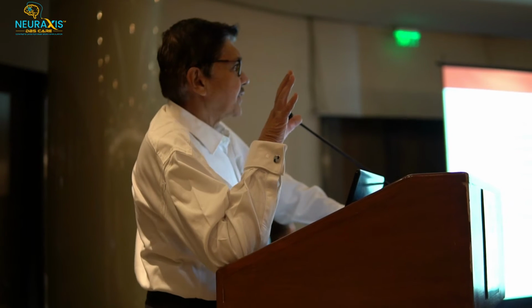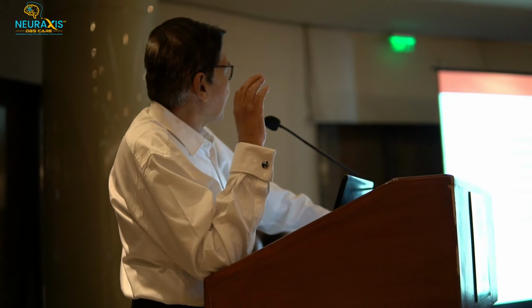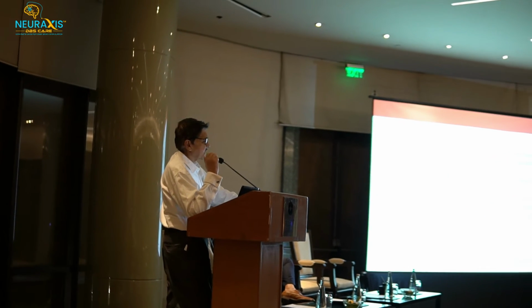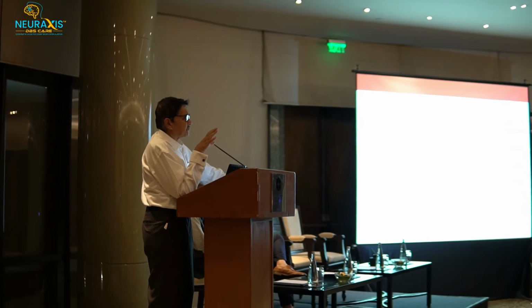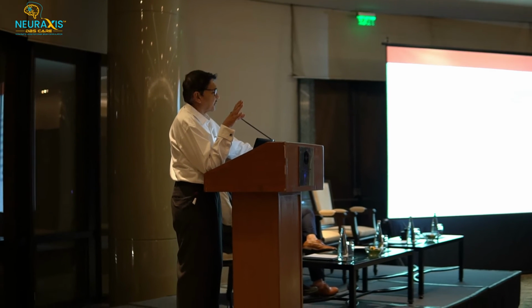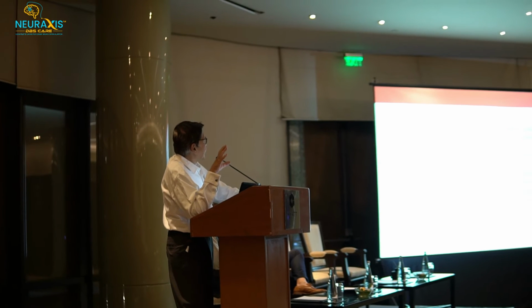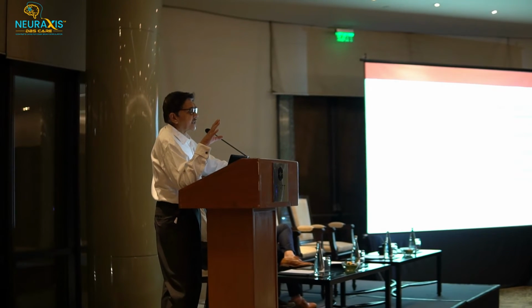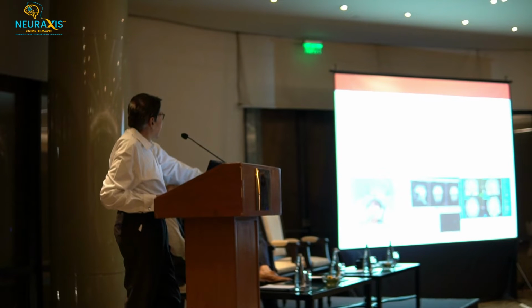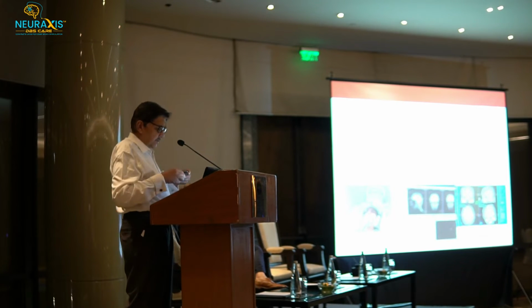Once we decide that we have to plan a DBS, how do we go about it? We do a proper pre-operative workup. We do a 3 Tesla contrast MRI for the anatomical localization of our targets. Then we do the intraoperative targeting of the desired nucleus, that is by doing the stereotactic MRI. And then we feed this MRI into our planning station, which is in our operation theatre.